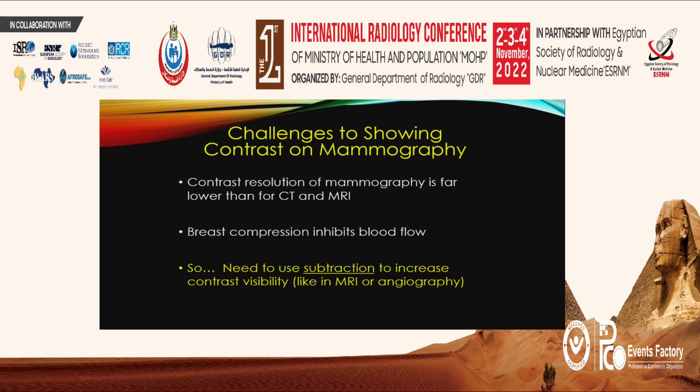But it's much harder to show contrast on a projection technique like mammography as opposed to CT and MRI. In addition, when you're dealing with mammography, you're compressing the breast, and that decreases blood flow and makes contrast uptake less. So we need a way to use subtraction to increase contrast visibility, and ideally a way to not compress the breast during the contrast injection.